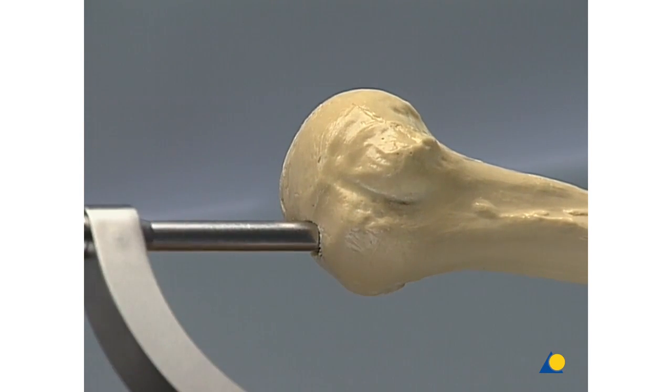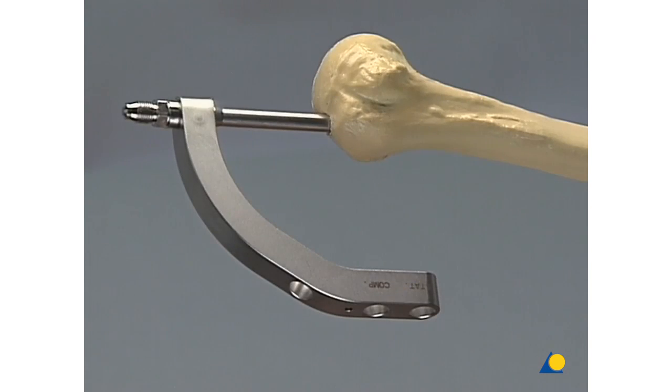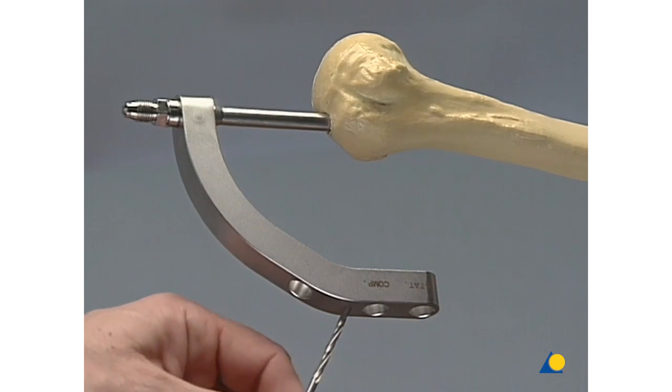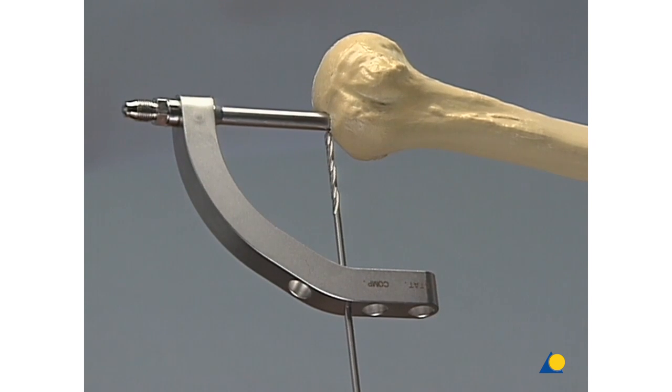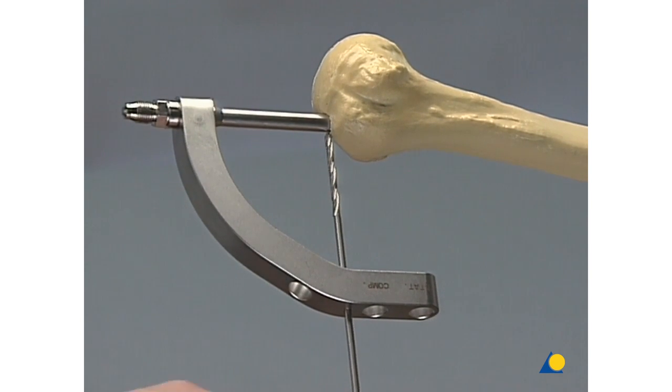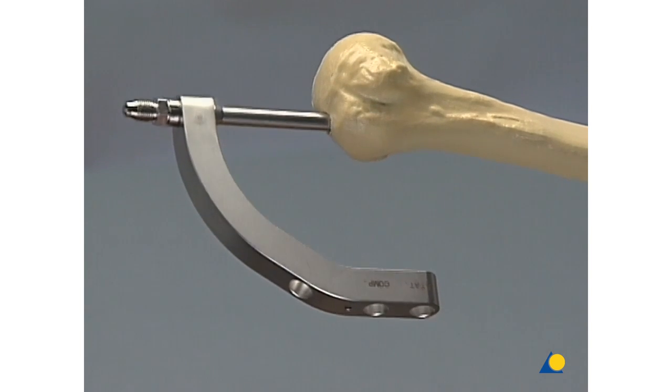To check the depth of the nail, insert a 3.2 mm drill bit through the hole in the insertion handle. Bury the nail completely into the humeral head to avoid subsequent irritation of the shoulder structures, even when the arm is adducted.